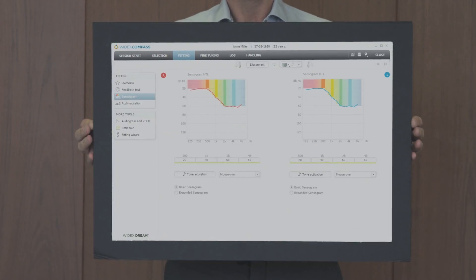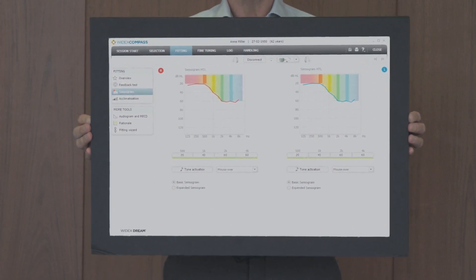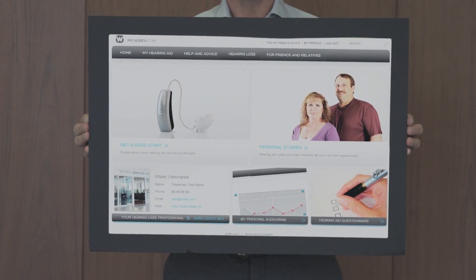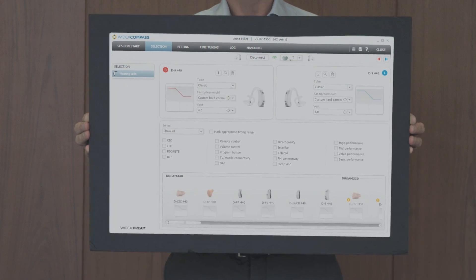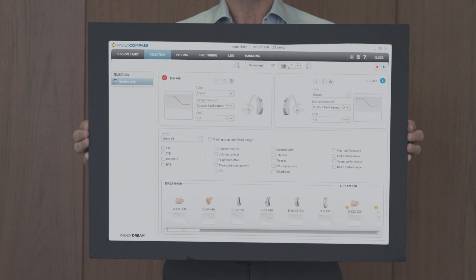And we've retained the option of in-situ fitting with Sensogram and our feedback test. The new compass also works with the upcoming mywidex.com user platform, while there's also a selection tool to help you quickly and easily find the right hearing aid for your customers' needs.